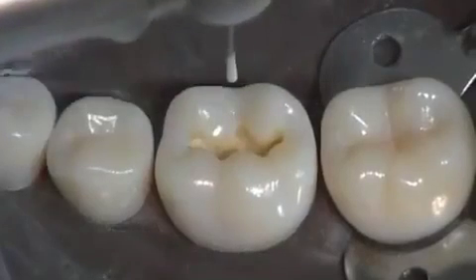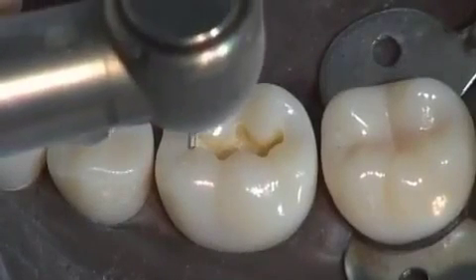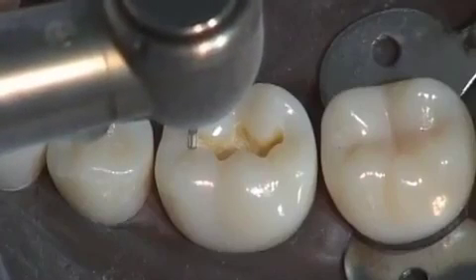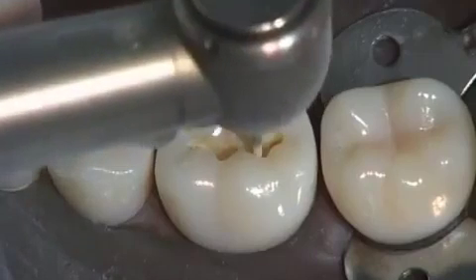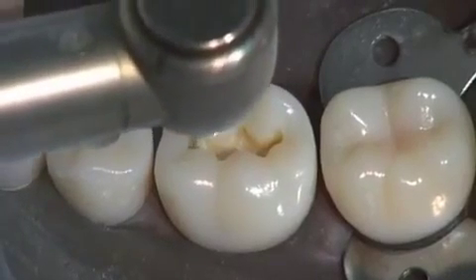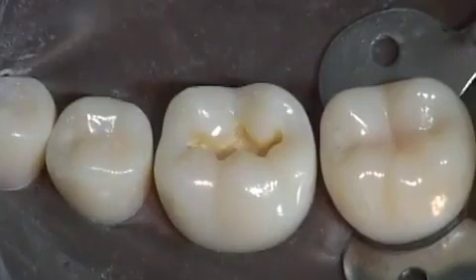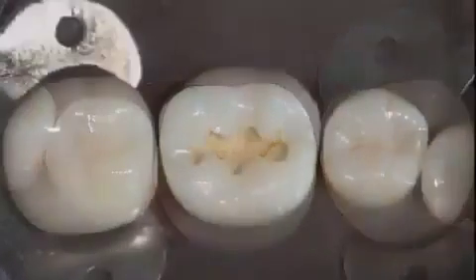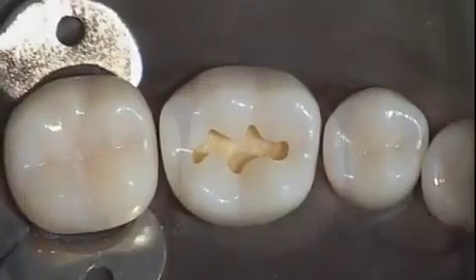Extend mesial and distal and buccal and lingual along the natural grooves of the tooth to incorporate the extent of disease until you reach sound tooth structure at the perimeter of your preparation. Ensure that the walls are smooth and rounded. From an occlusal view, verify that your preparation walls converge towards the occlusal surface.